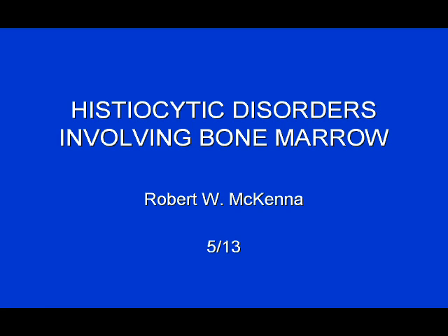The lecture that follows is on histiocytic disorders involving the bone marrow. Now, this is a group of disorders which are not particularly common. In fact, they're not common disorders in any tissue, but they are quite uncommon in bone marrow.